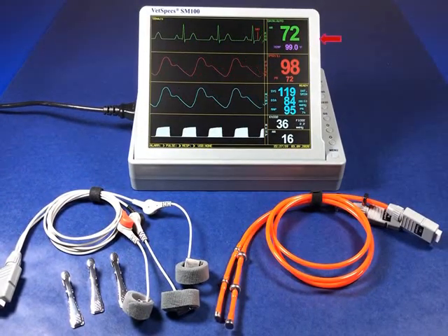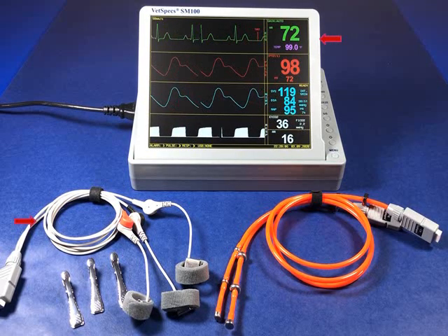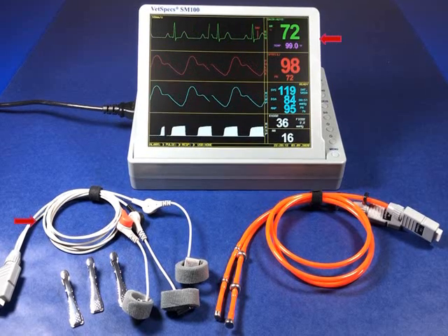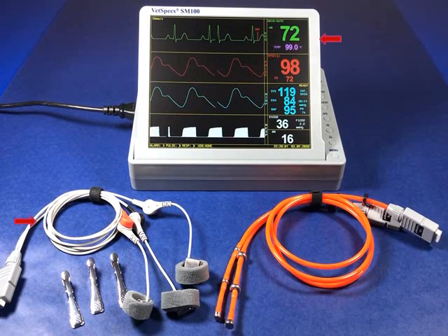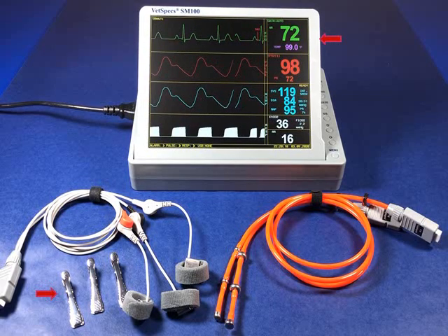To obtain an ECG via connection to the patient's body, VetSpecs includes a specialized set of three-wire limb plate leads which provide quality tracings without the concern of slipping off or causing damage to the patient's skin, which is often the result of aggressive alligator clips included with most human-based systems. Should clips be preferred, VetSpecs does have available our optional atraumatic flat clips which are ideal for short-term ECGs.